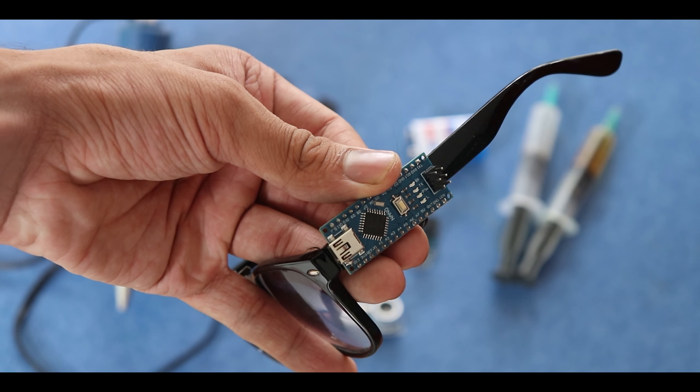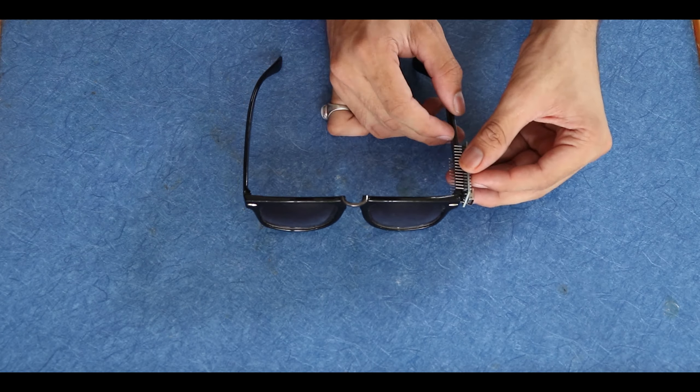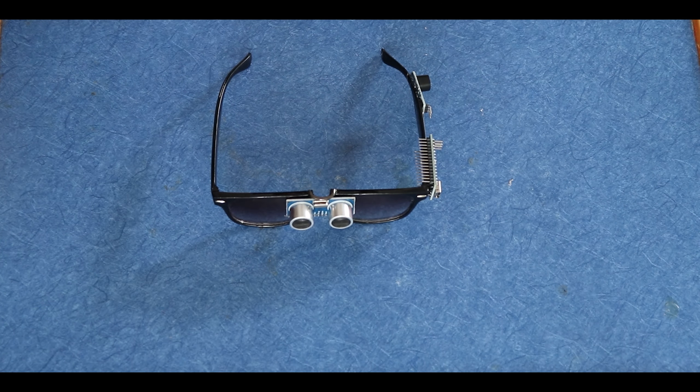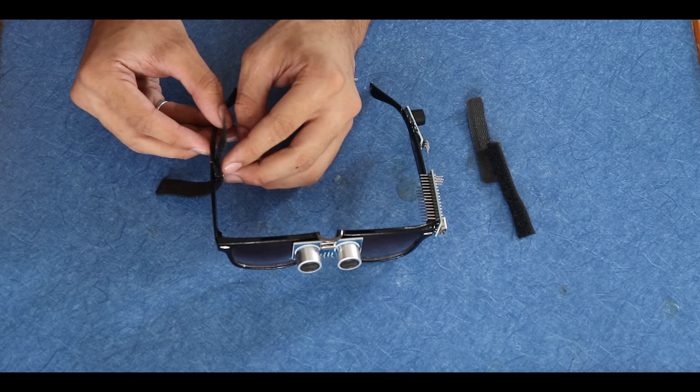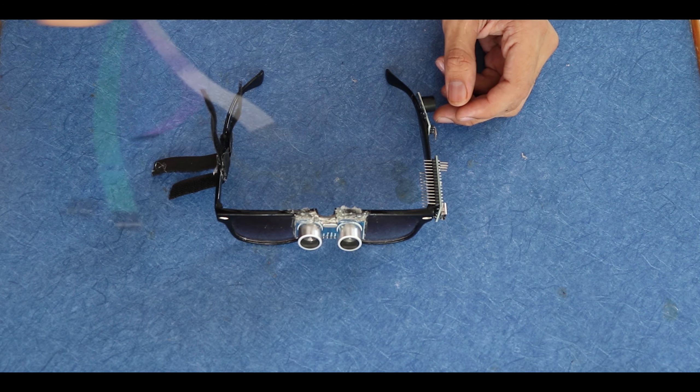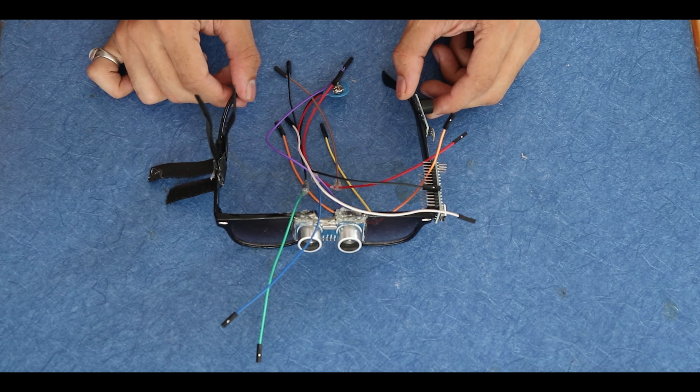You will also need a soldering iron, a scissor, and a velcro which you have to divide into two pieces. You will also need a glue gun, or alternatively you can use araldite. Now take your two jumper wires and cut one of them in half.